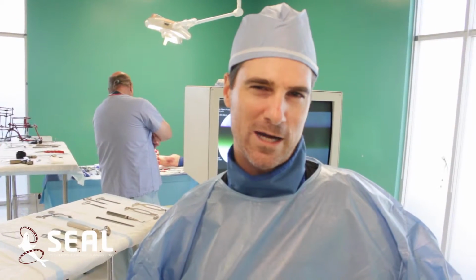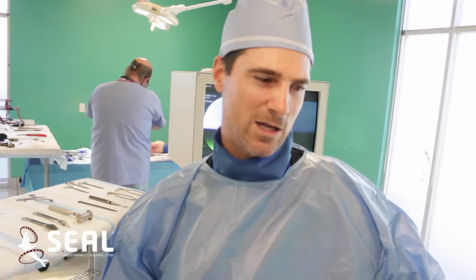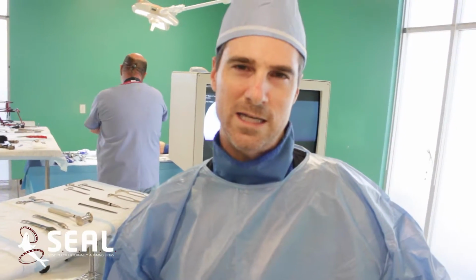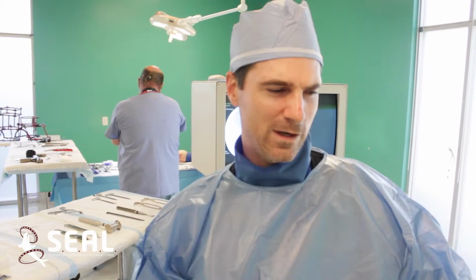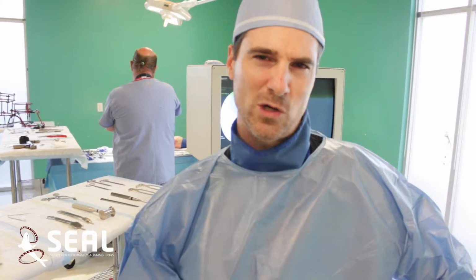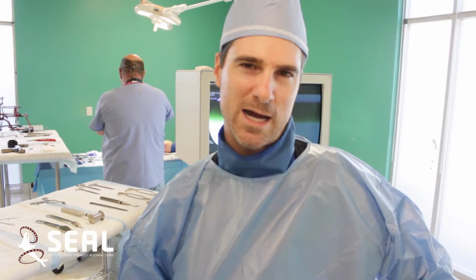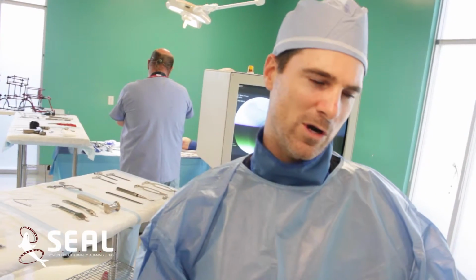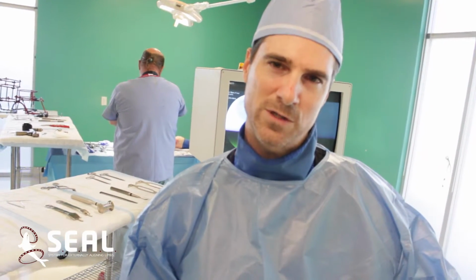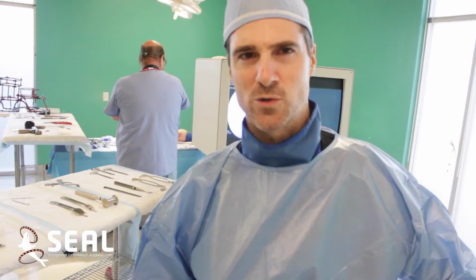It's difficult to describe in a quick video segment, but cases that would need multiple procedures and have variations performed throughout the healing course, especially with gradual correction of deformities, we're able to accomplish with one device. We can have all of our modifications performed in the office instead of bringing the patients back to the operating room to perform these gradual corrections.